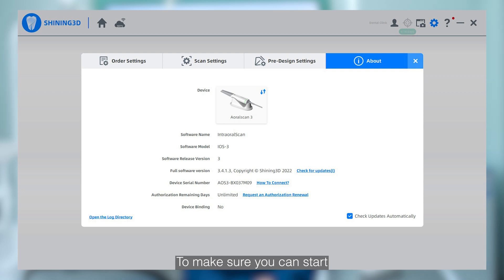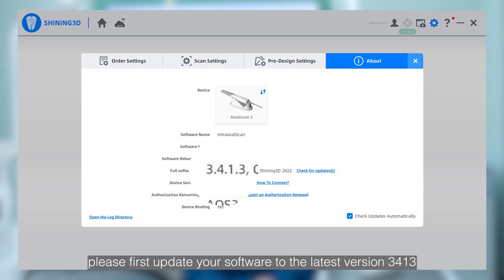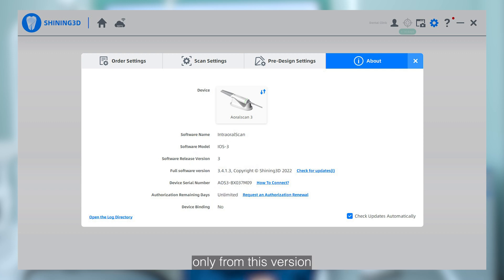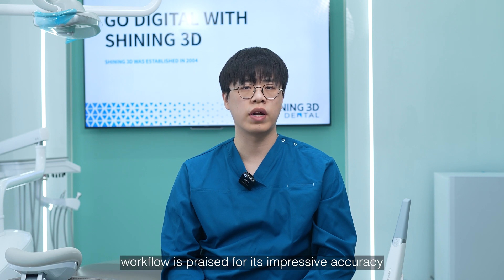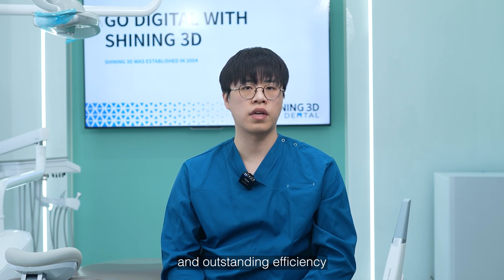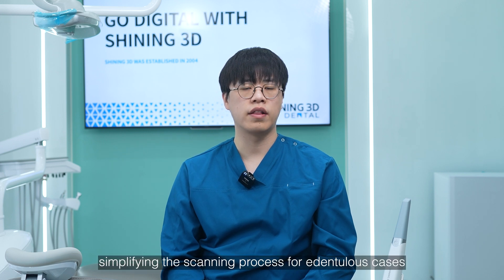To make sure you can start enjoying this workflow, please first update your software to the latest version, 3.4.1.3. Only from this version is this amazing workflow available. The new removable denture workflow is praised for its impressive accuracy and outstanding efficiency, thanks to our optimized algorithm, which simplifies the scanning process for edentulous cases.